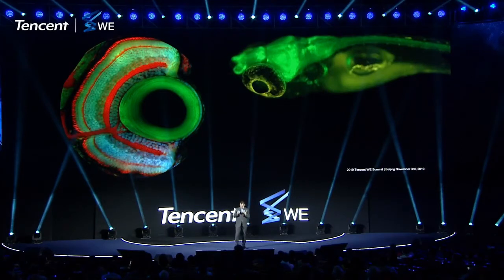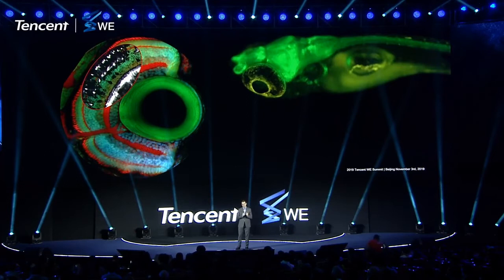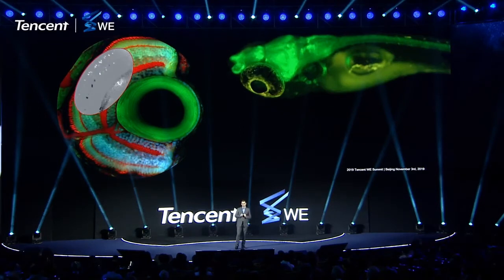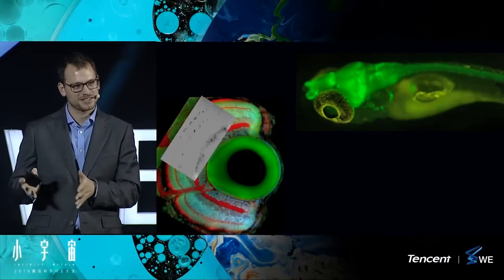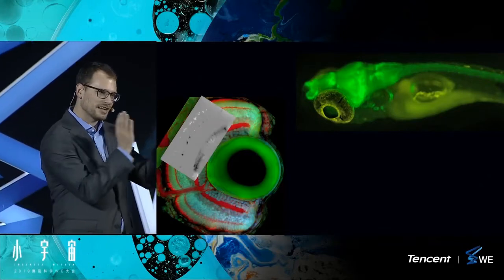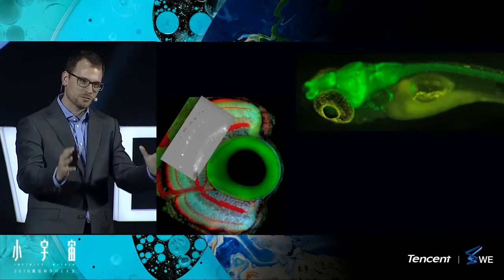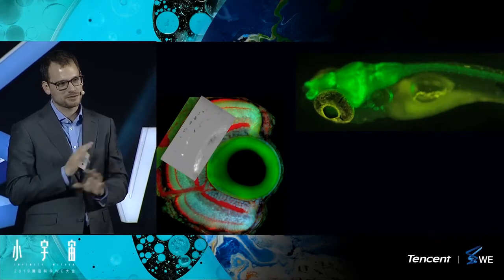So what we can do with this kind of setup is we can now express these activity marker proteins in specific cells within the eye, and then we can shine light into the eye of the animal while it is alive, while it's processing the information, and we can watch the nerve cells in the eye do their job. And this is what this might look like. The stimulus in this case is just a flash of light. We switch on the light, we switch off the light, and we repeat. And what you can see is that the different layers of nerve cells in the eye process this information and respond not all in the same way, but in different ways. Some respond when you switch on the light, some respond when you switch off the light, and some do something completely else.